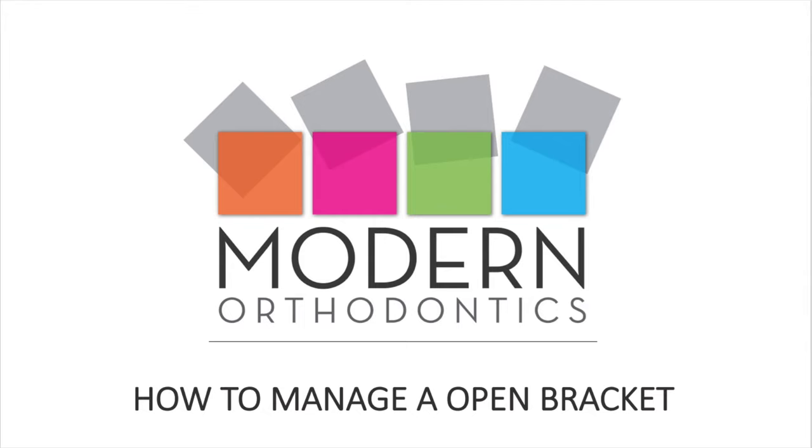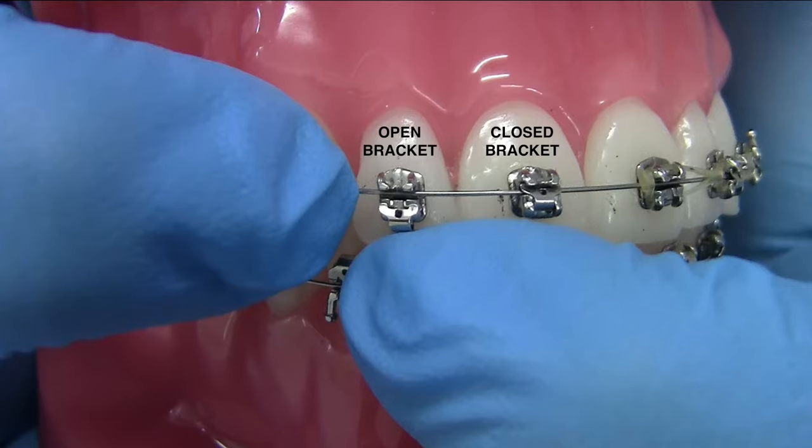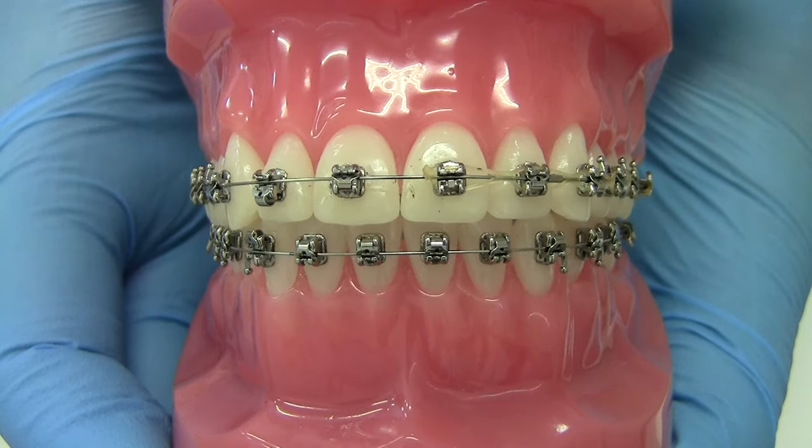How to manage an open bracket. The cause of an open bracket could be due to eating any hard or sticky food, or the pressure of the arch wire.